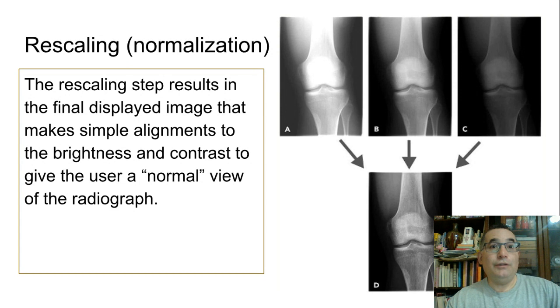And again, if we don't like it, very often technologists will go ahead and try to window and level and adjust the image to make it a little bit better. We just have to be careful when we do this, because our monitors, as we've discussed, are not nearly the same as what the radiologists and physicians have in some of their offices, and potentially in the ER and the OR.